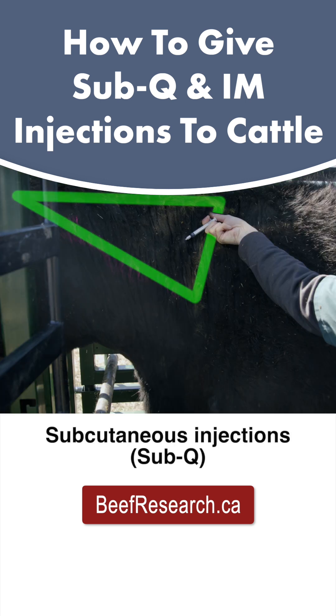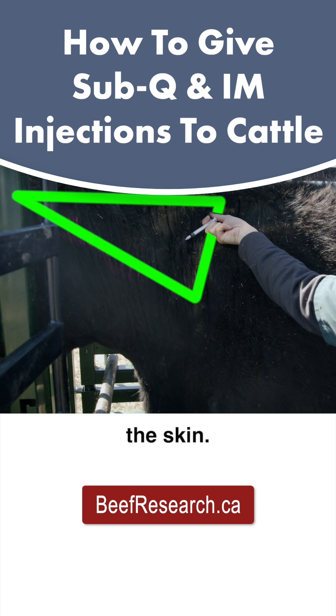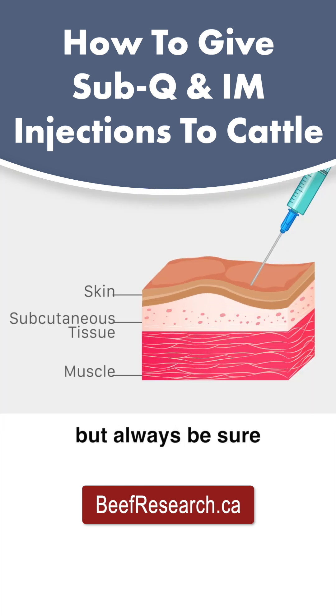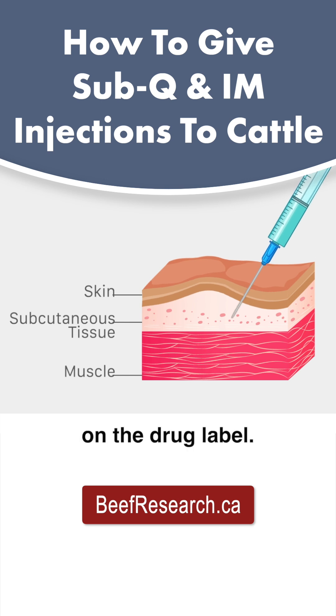Subcutaneous injections, or sub-Q, are placed just under the skin. They are generally less irritating and are the preferred route of administration. But always be sure to follow the recommendations on the drug label.